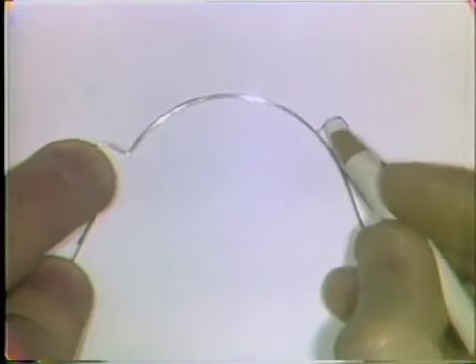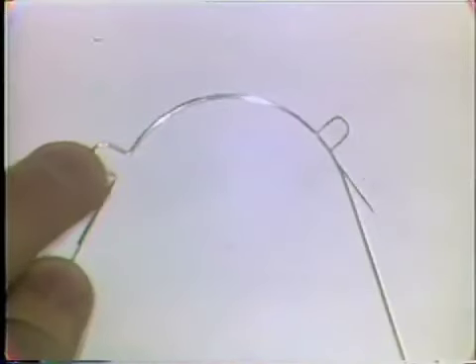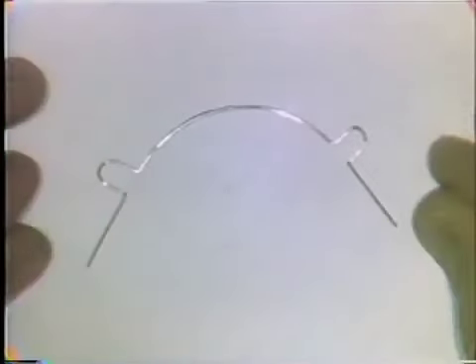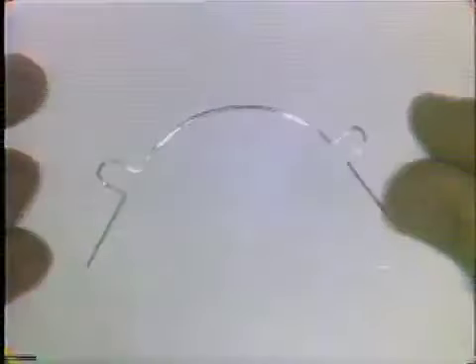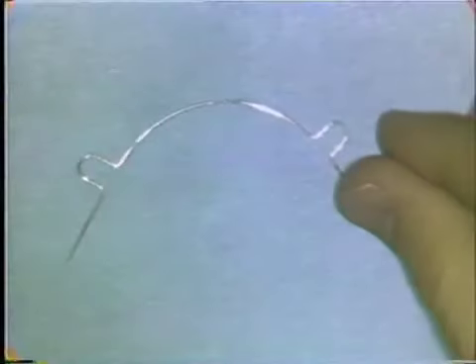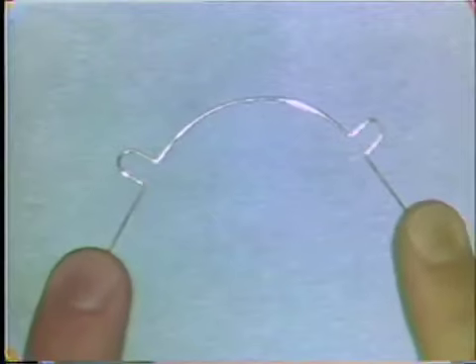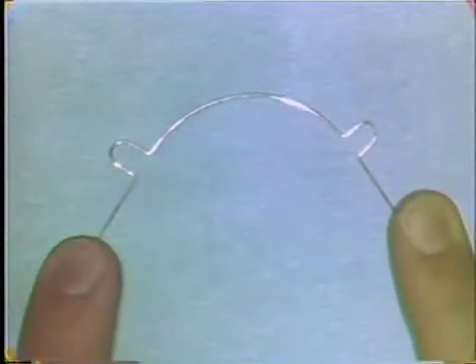The completed wire fits exactly over the lines of the pattern. It is free of nicks and surface defects, and it should be flat on a flat table surface or glass slab.